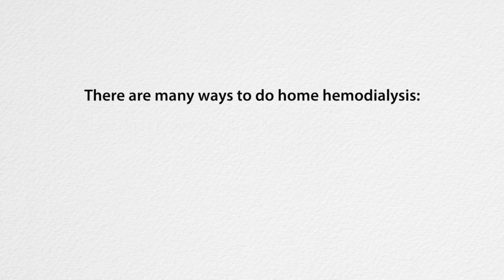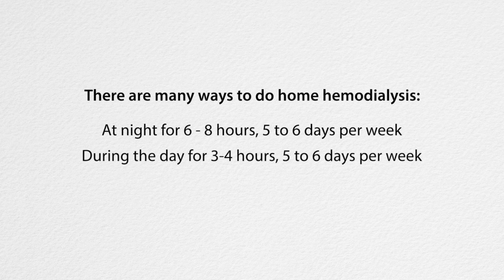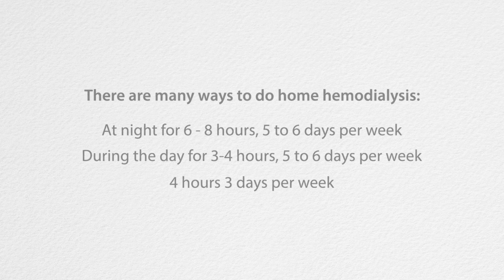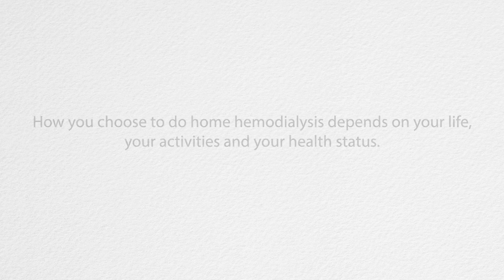There are many ways to do home hemodialysis. At night for 6 to 8 hours, 5 or 6 nights per week, or during the day for 3 to 4 hours, 5 or 6 days per week, or 4 hours, 3 days per week, such as Monday, Wednesday, Friday, or Tuesday, Thursday, Saturday, or Sunday. How you choose to do home hemodialysis depends on your life, your activities, and your health status.